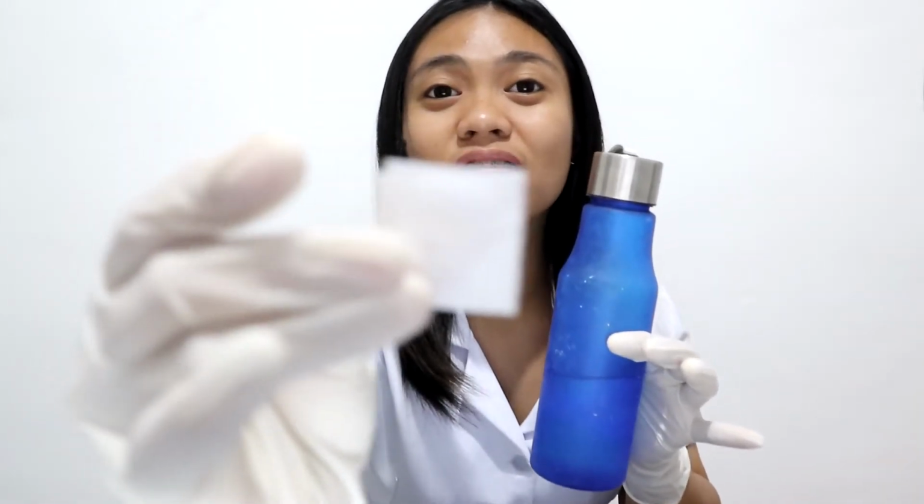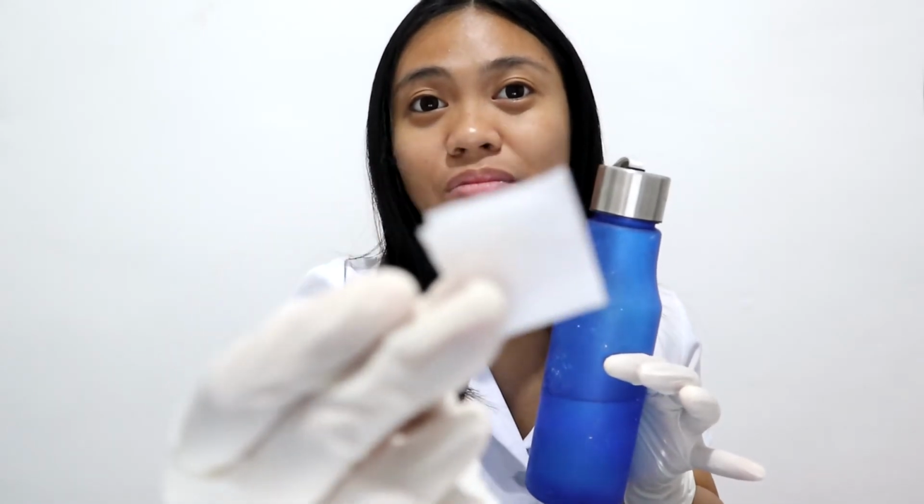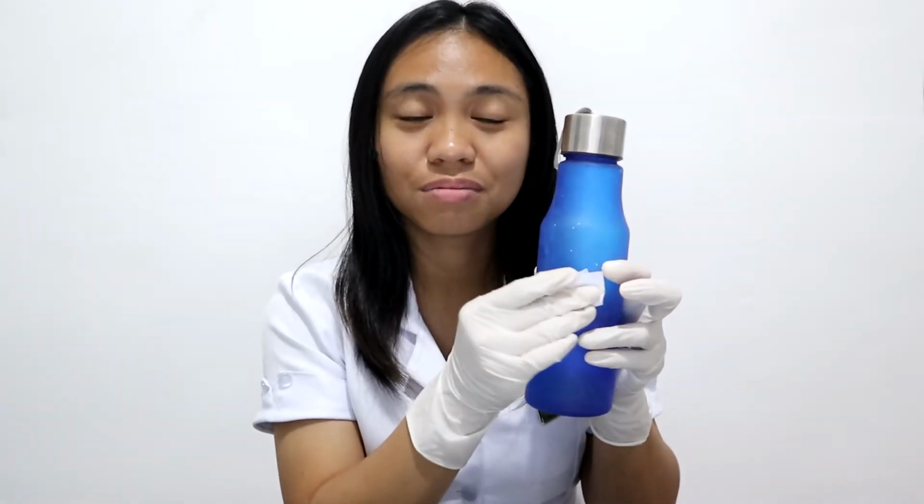After placing the tourniquet, you should locate the possible vein where you will perform the venipuncture, then release it. So after releasing the tourniquet, you have located the vein where you will do the venipuncture. Clean the area where you will do the venipuncture using the alcohol prep pad. This is the inside of an alcohol prep pad. You should clean in a circular motion like this.